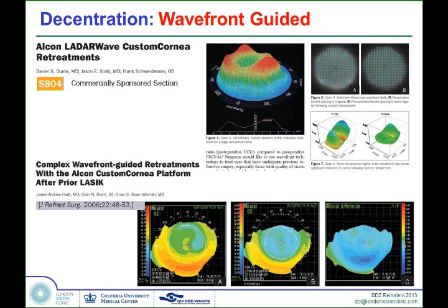You can see that the wavefront was optimized, not flattened, and you can see the asymmetry in the ablation profile. In this case, you can see that the topography shows how decentered superiorly the optical zone was pre-op, and nicely recentered post-op.